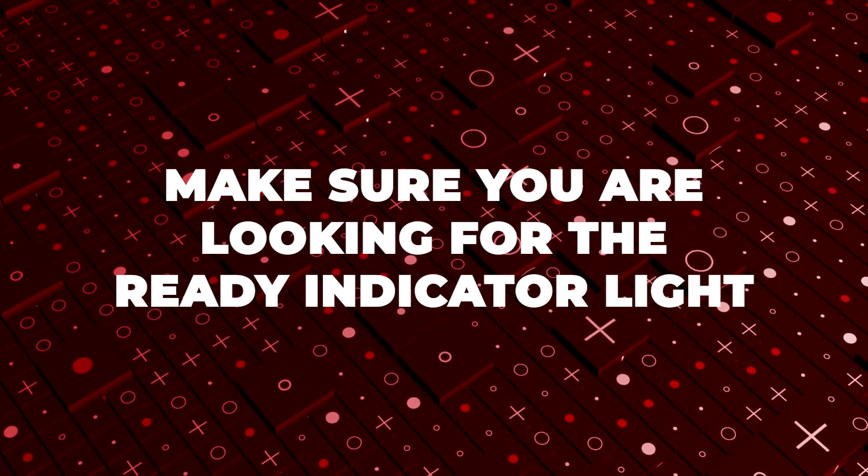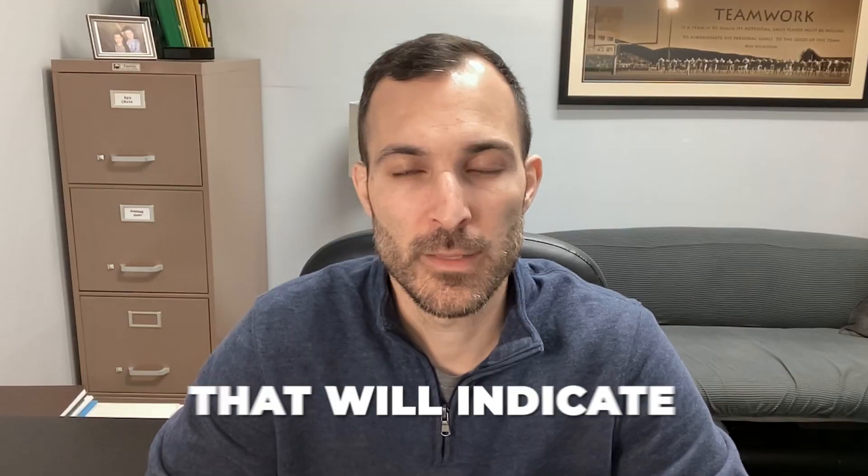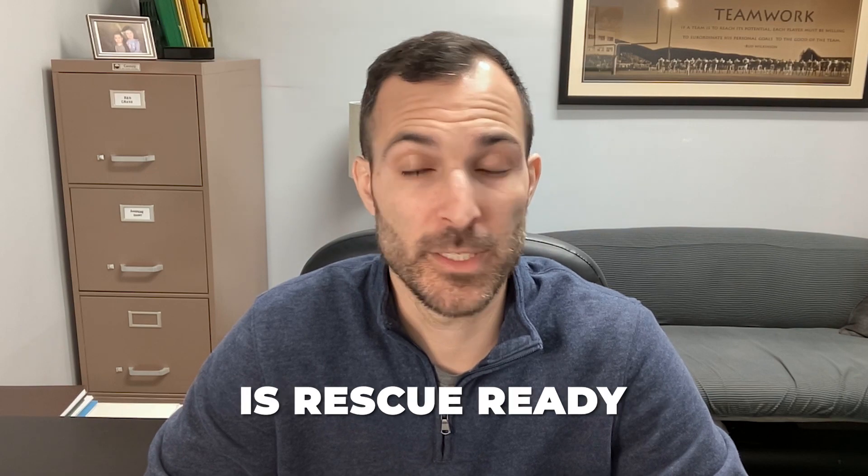So when we do this, there are a couple of things that you want to look for. Number one, you want to make sure you're looking for the ready indicator light. What this will look like on most AED machines is a green flashing light that'll be beeping, which will indicate that your machine is rescue ready.